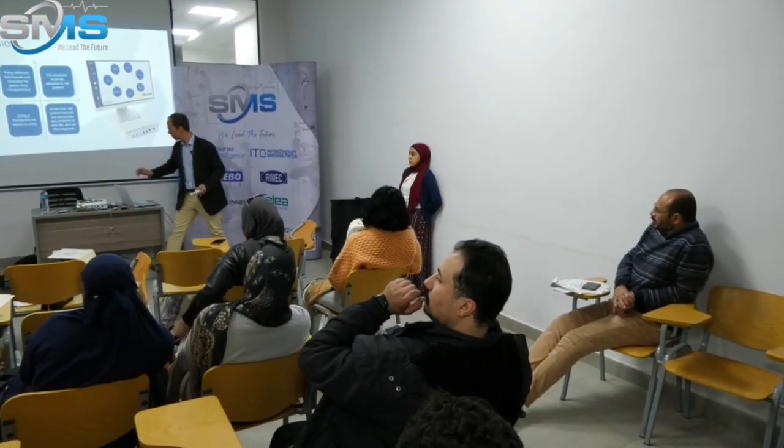It's like the EMG. Yes, that's EMG, and stimulation both. It's just like a surface electrode but inside, just the same. But the other one, the rectum, picks up the pressure. This one is only pressure, yes, and only anorectal.